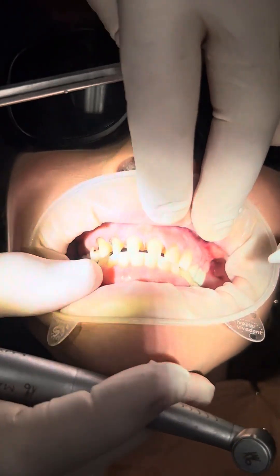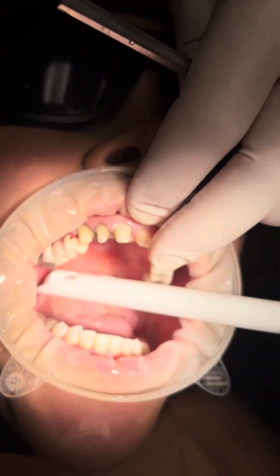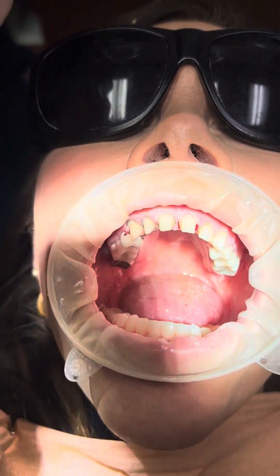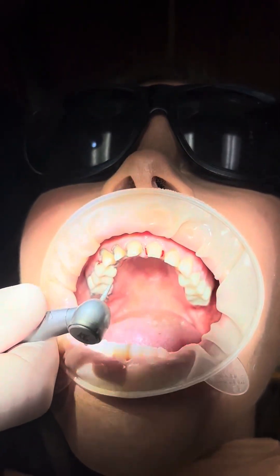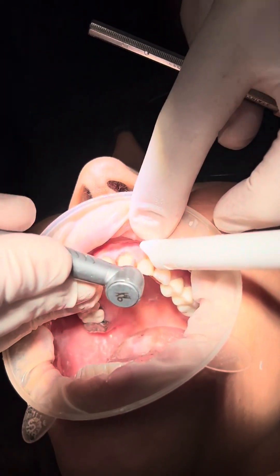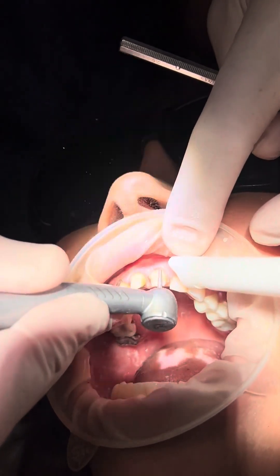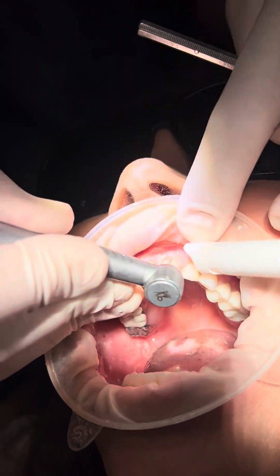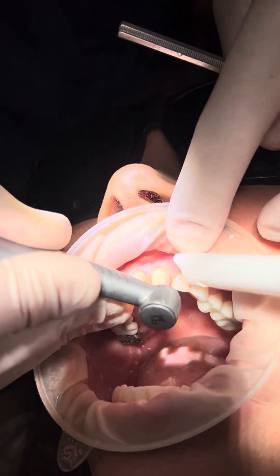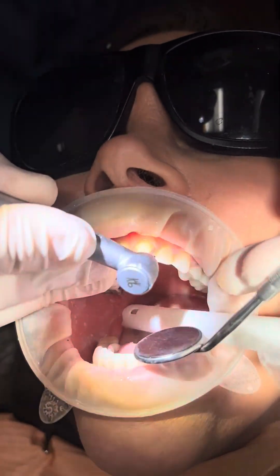Now we're going to check — bite together. I can see I'm almost perfectly back to the prep on the lingual. Now we're going to go and refine the margin. We have a round-end bur — this is an 018 there, and we have 016 for the lingual sizes. For the central here, we're going to do our final side of the margin, round everything off. We do need a millimeter and a half to two millimeter shoulder — at least a millimeter and a half shoulder. I'm going to use the indirect vision and turn back to refine the margins on the lingual.